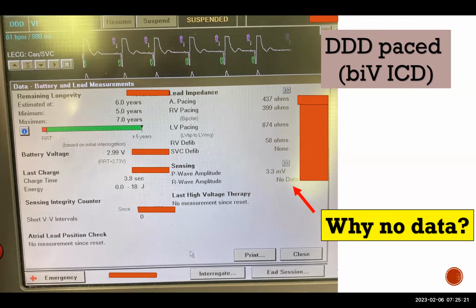I know that we had said in the past we don't set the sensitivity less than 1.2 millivolts, so that would be less. One would be less than half of 3.3. So I think it's okay. That's a good logic there.